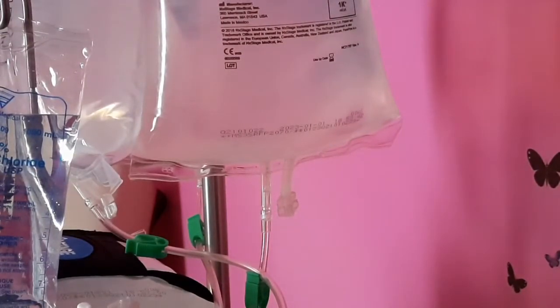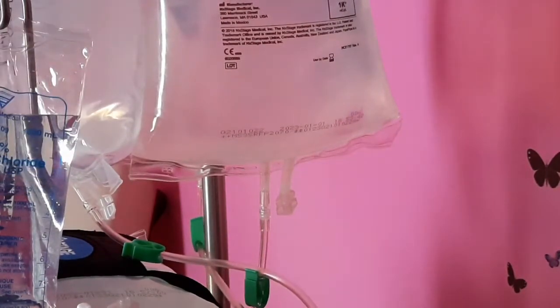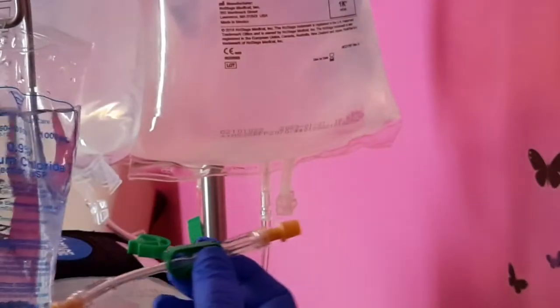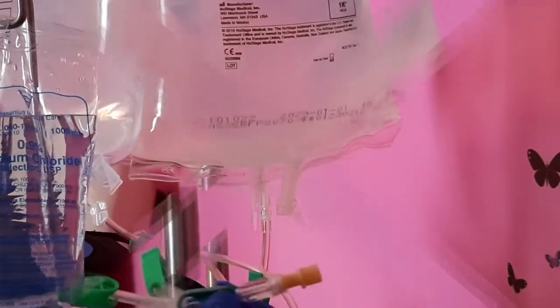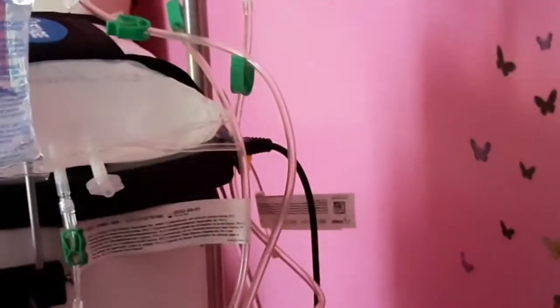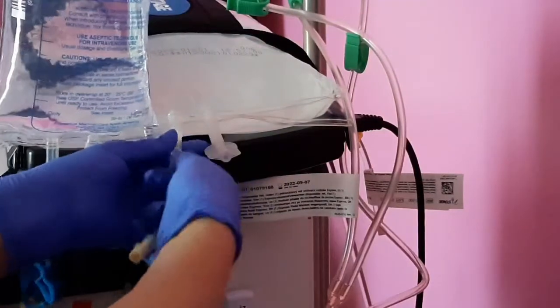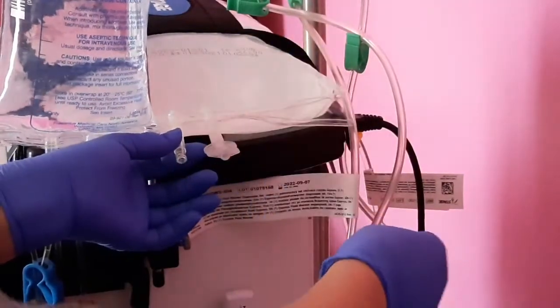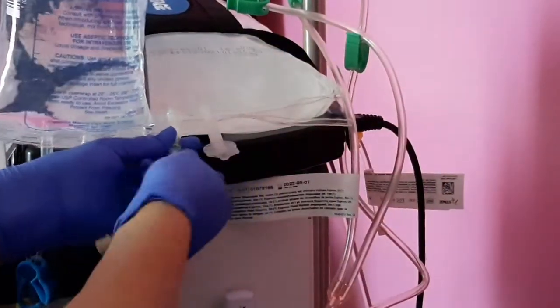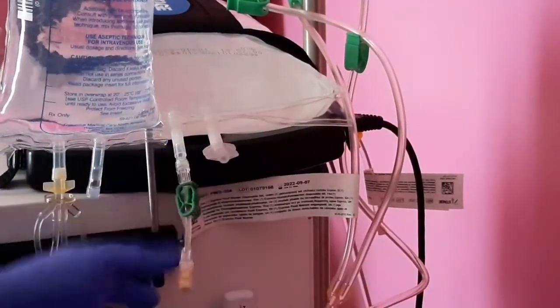So now what we're going to do is remove this little tab right here at the bottom. This is your dialysate line. It'll attach to the other green line. Anyway, this is what I did. I connected, let me show you. I connected this little dialysate piece that was attached to the MLA pack, and I screwed it onto that port that has the white cap, just like these did.